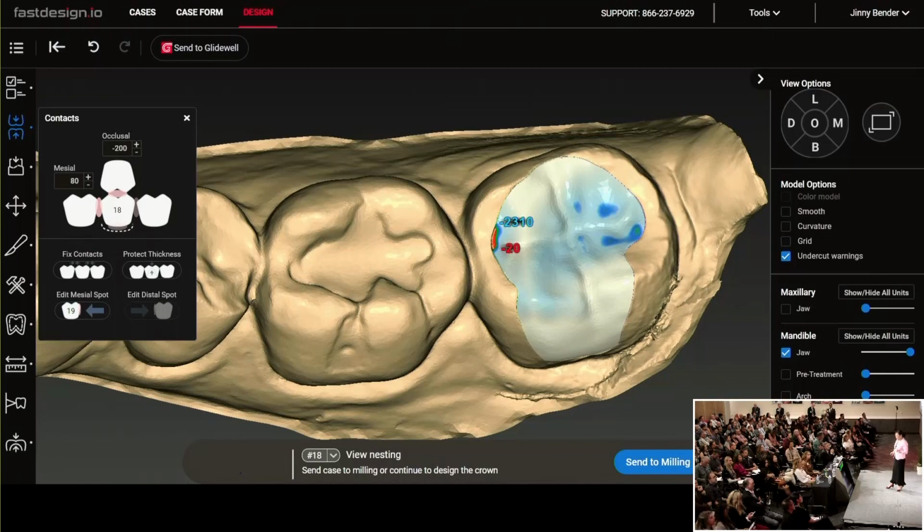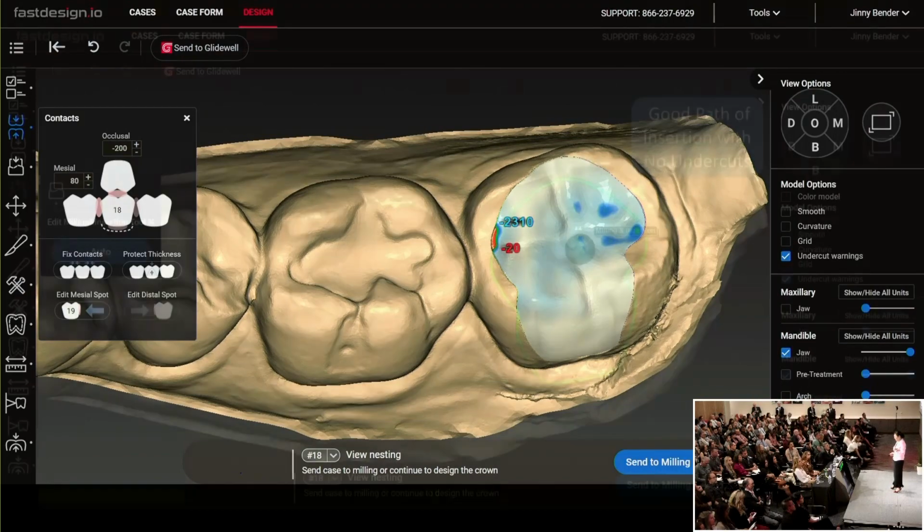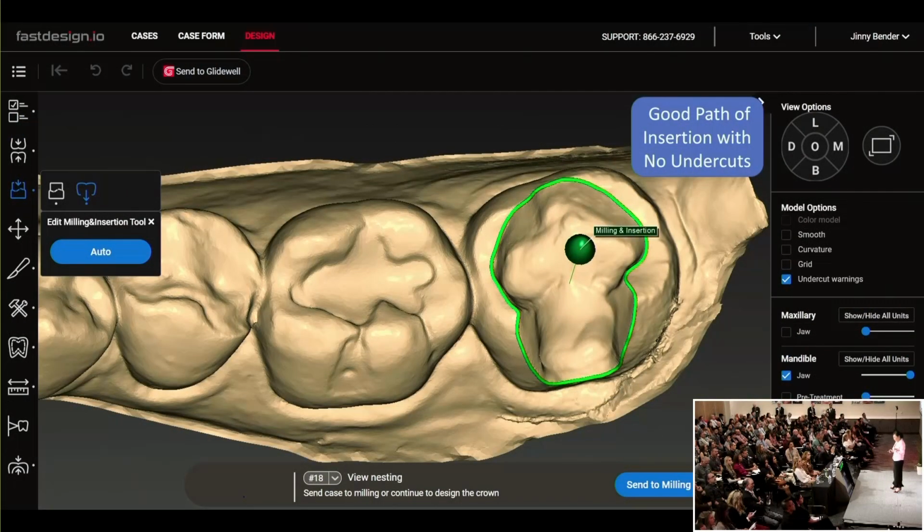And then with the restorative proposal, again, I did not have to do much. Just clicked it. I noticed there's one spot that's going to be a little bit thin. I keep that in mind when I deliver. And I always use this tool, milling and insertion. Make sure that you see green. Make sure you have that path. Very important.